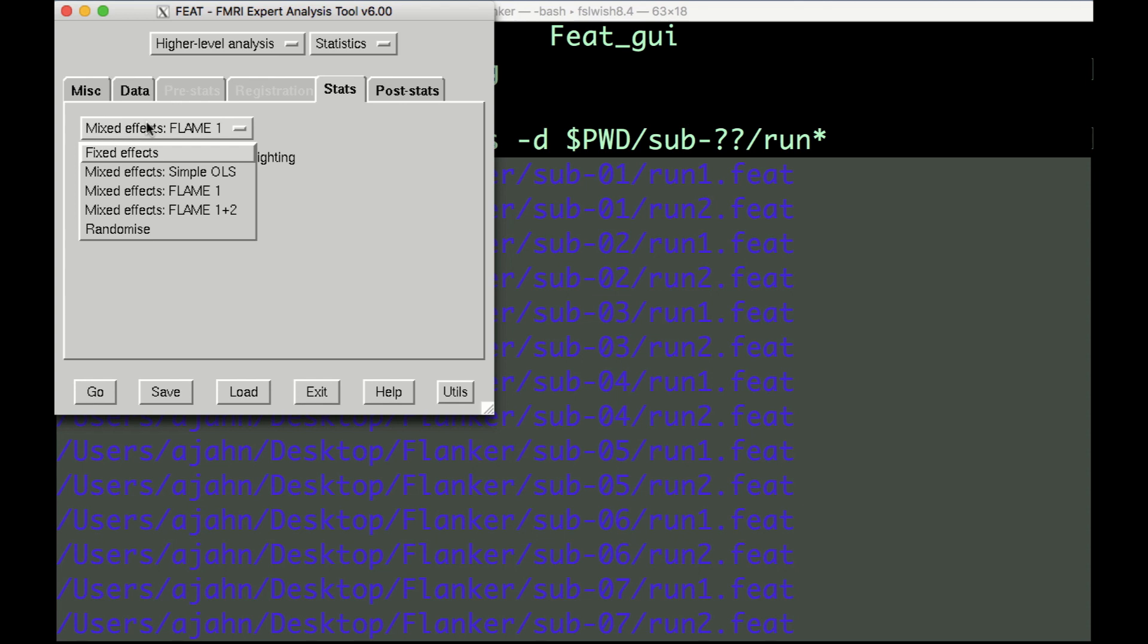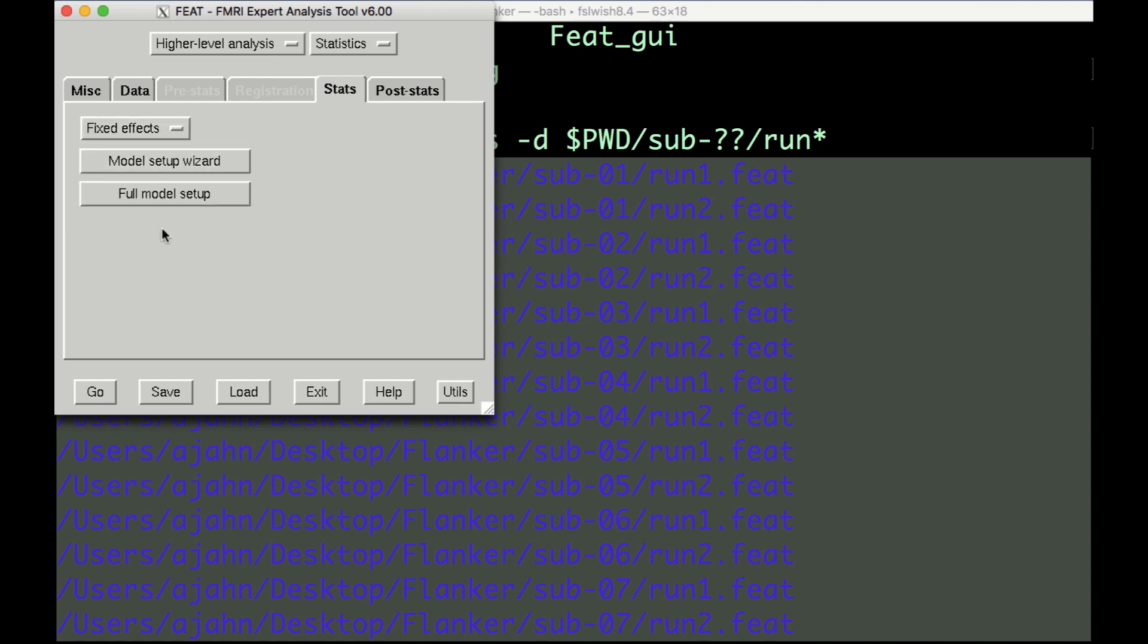Since we simply want to take the average of the parameter estimates across the runs within each subject, we will use the Fixed Effects option.